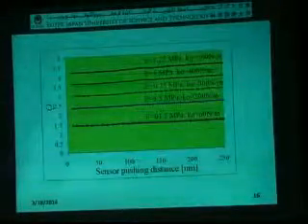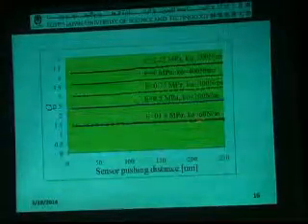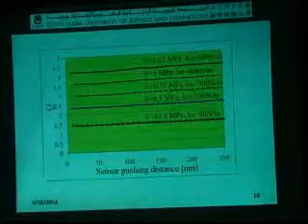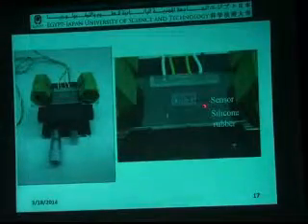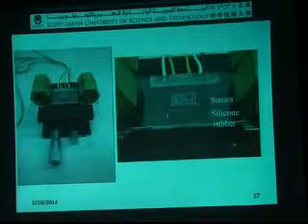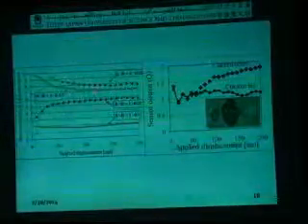the reading of the sensor is very stable. If you push inside the tissue, the reading is very stable. You can observe here is soft tissue, here is medium, hard, harder, and hardest. So you can detect the hardness of the tissue. And we examined it with some kind of silicone rubber, and here is our sensor, and here is the electronics.